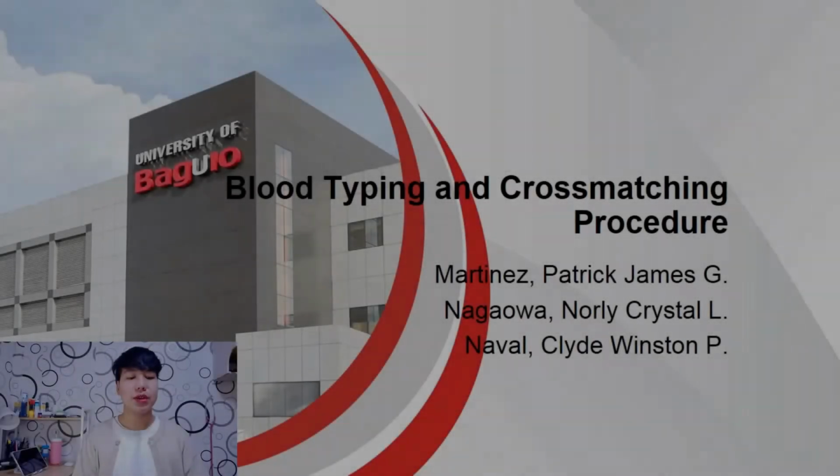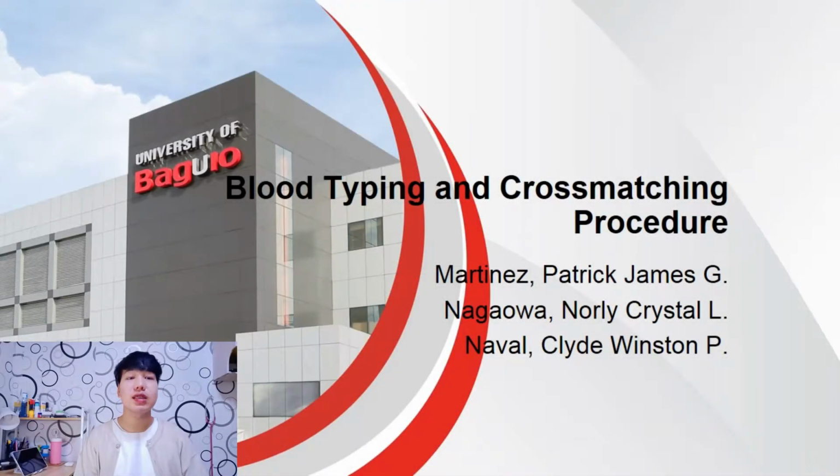Good day po ulit. So we are Group 4 Blood Banking naman and we will discuss about blood typing and cross-matching. So to have an overview of our topic, let us define these two terms first.